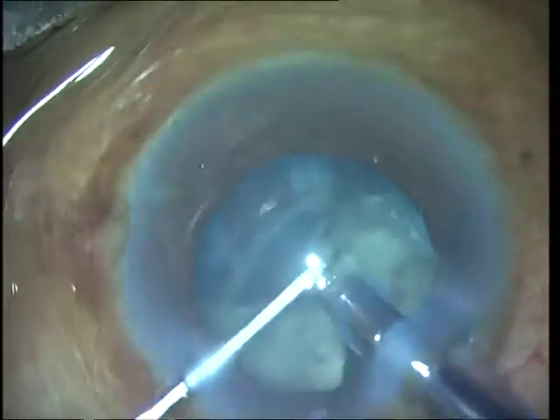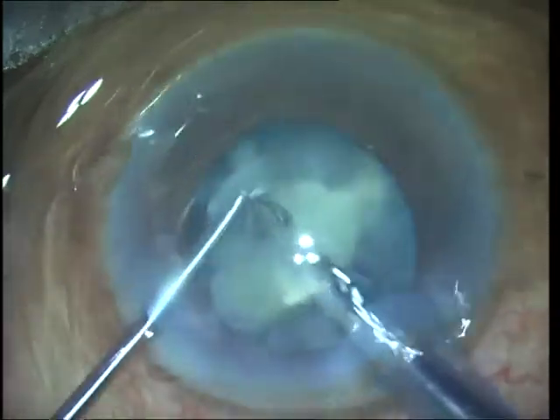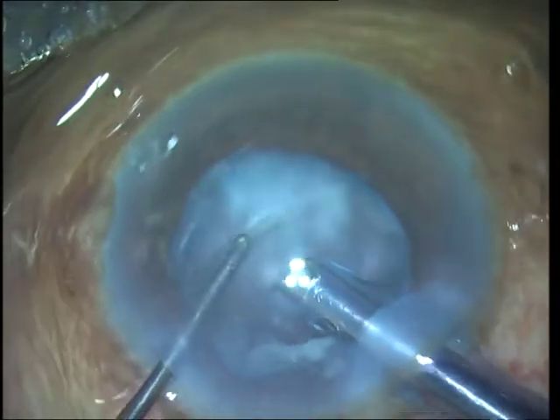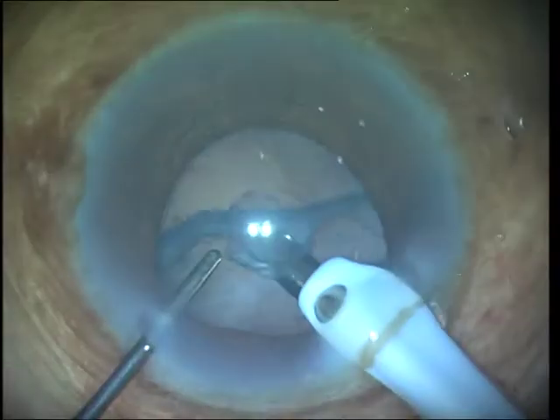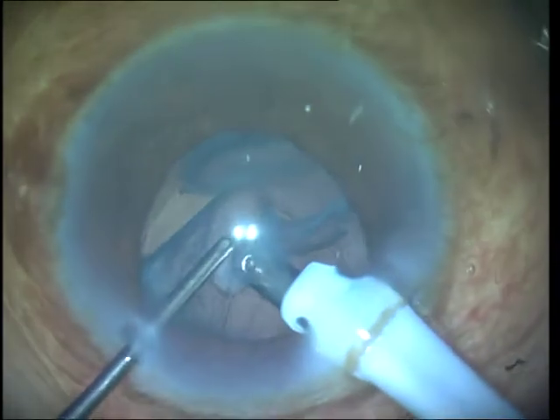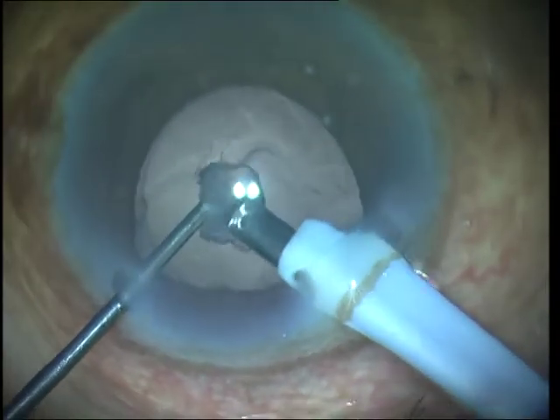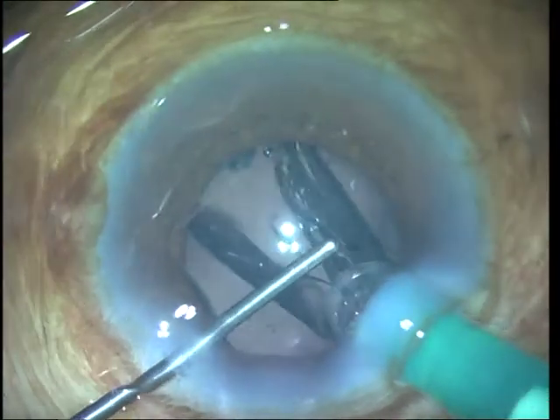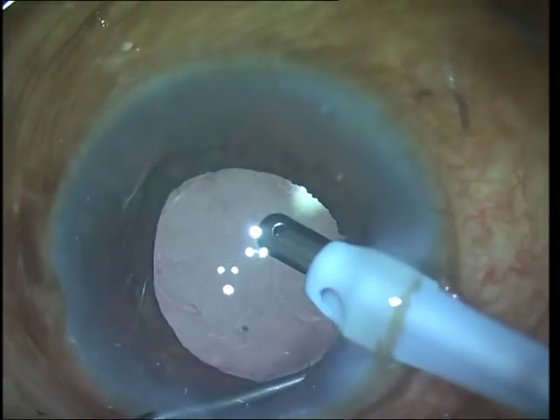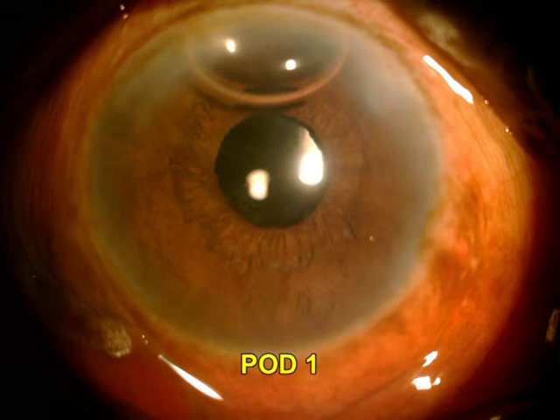Once you are down to the last pieces you work more anteriorly, since there is not much cortex or epinucleus for these cataracts and therefore the capsular bag is floppy and can come forwards and get caught in a post-occlusion surge if one is not careful while the last fragments of the nucleus are being removed. Cortex aspiration is finally done, followed by intraocular lens implantation. It is important to remove all the viscoelastic as normally done, and if a white cataract is emulsified well you can see that you get very good results immediately.